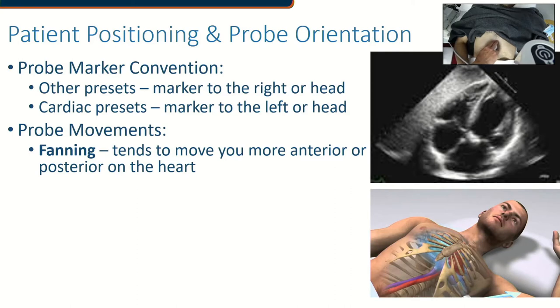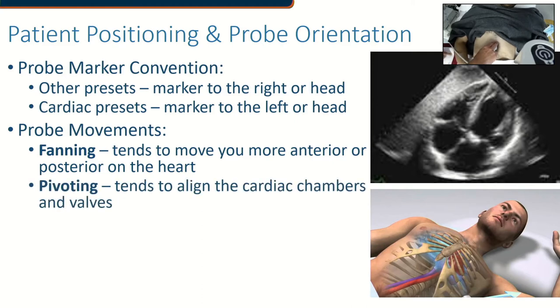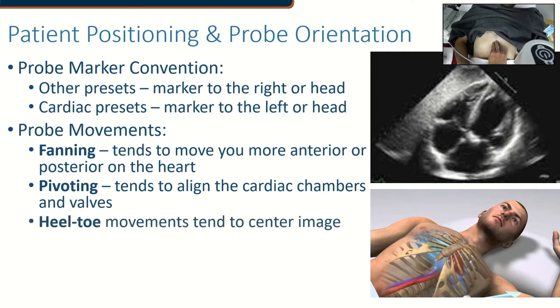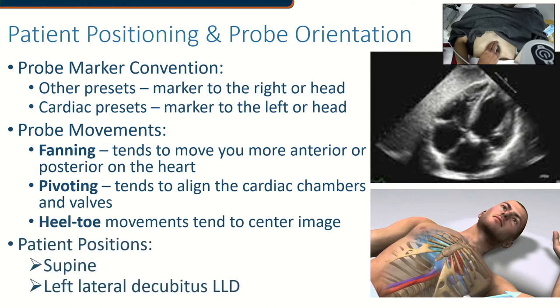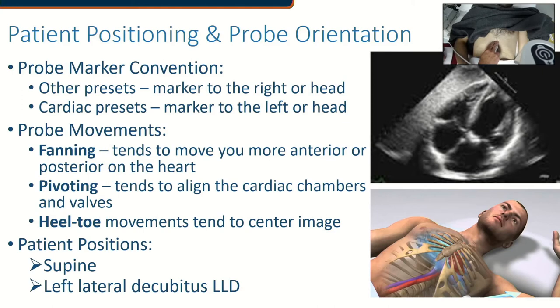Holding the probe this way also gets your hand out of your own way so you can lay the probe right down to the patient's abdomen. It also lets you pile gel into this space so it doesn't spread all over their body, and you can maintain good contact even with fairly robust fanning movements. The pivot helps align the cardiac chambers and valves by getting the actual axis of the heart in line. Heel-toe movements tend to center the image and align things in the midline.